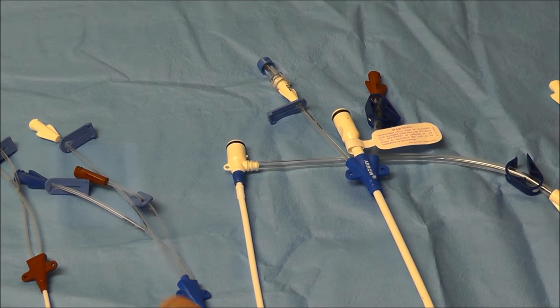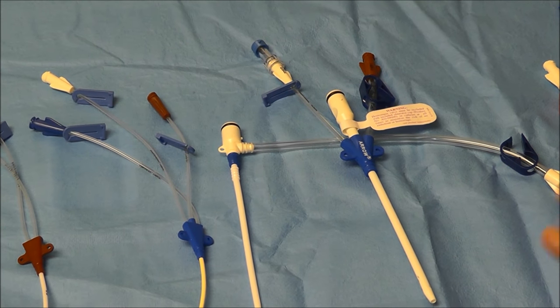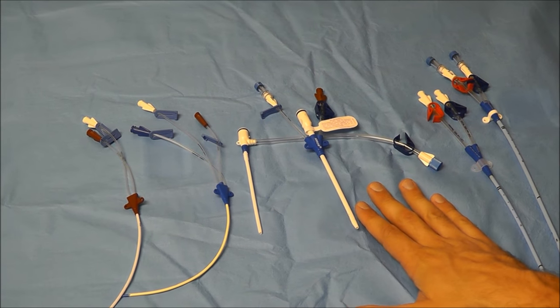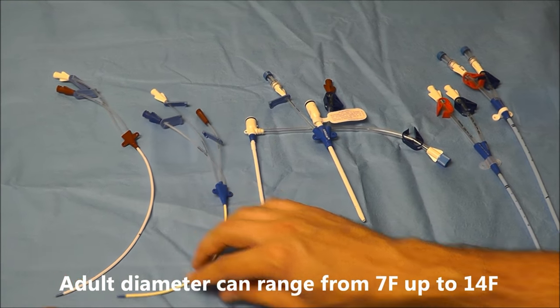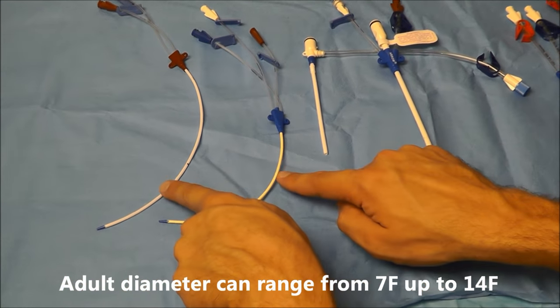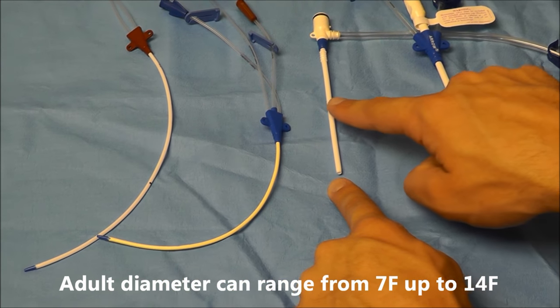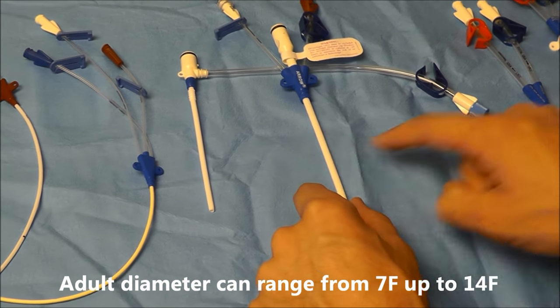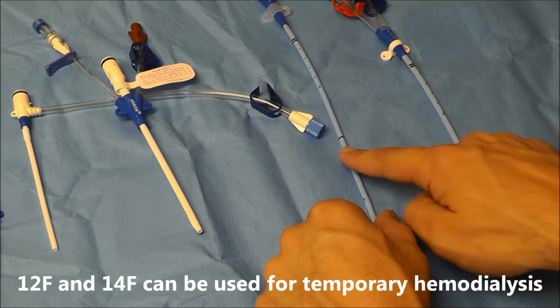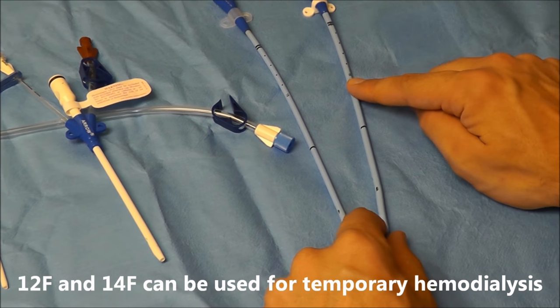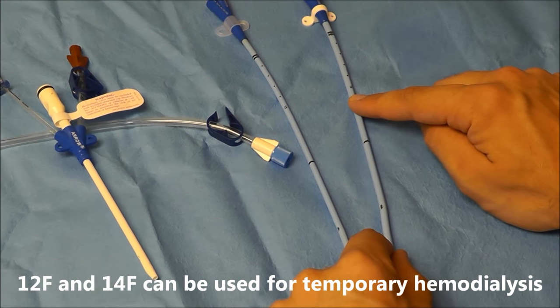The next thing that you're going to notice about these central lines is that some lumens are bigger than others. Typically the smaller types of lumens are around 7 French, then they go up to 8.5 French, 9 French, you can get up to 12 French and even 14 French on how big these lines can get.